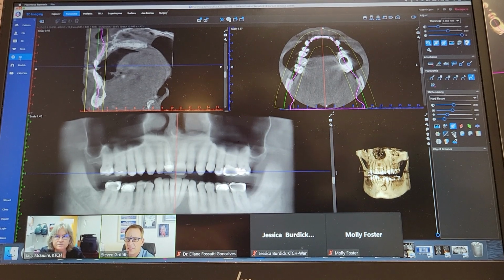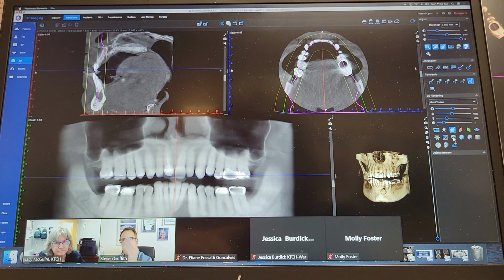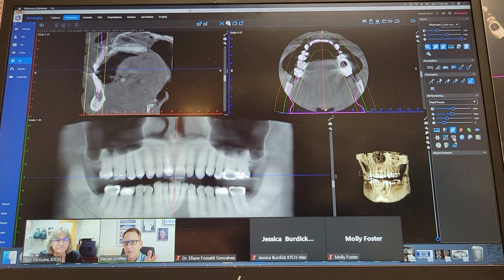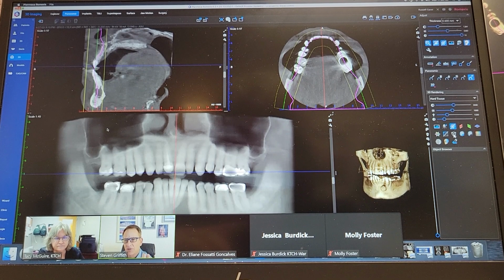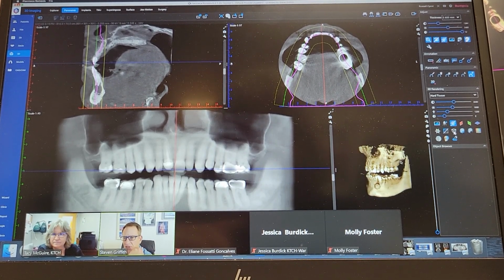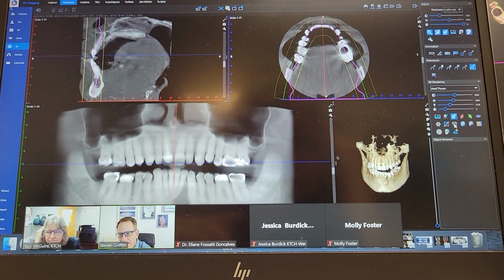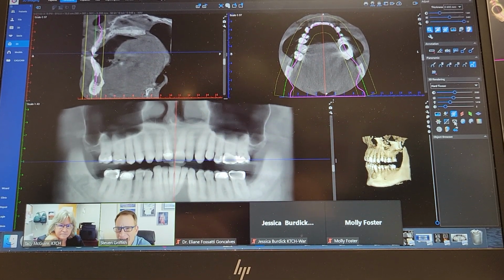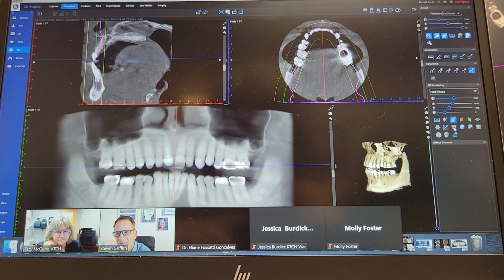Say, hey, Griff, what do you think this is? Because a lot of times it points a finger back to one staff member that maybe just didn't get this down, or they're the new staff member that hasn't been through the training, but it also helps the doctors, because now the doctors say, well, okay, I can see what we can do with this. I can see the usefulness. This image that this guy took up in Ogden is an ultra low dose image. All this anatomy that this guy got on this image is the radiation of 35 microsieverts. That's basically 3.5 PAs worth.